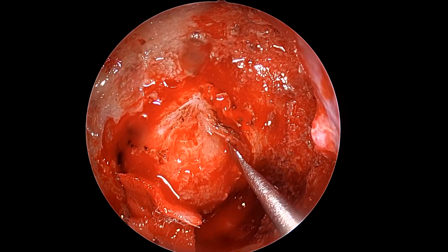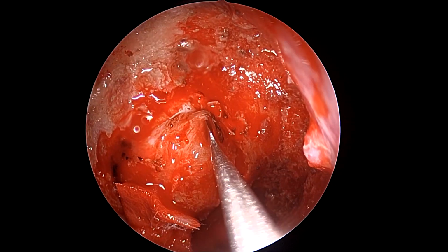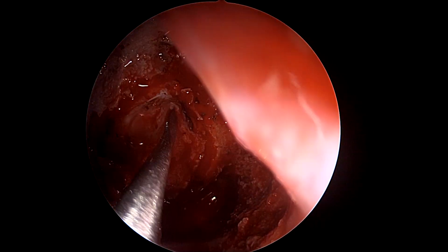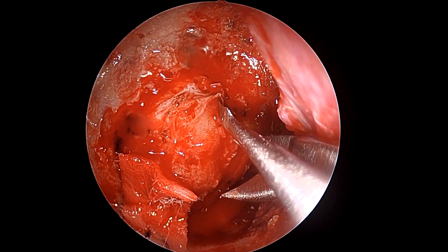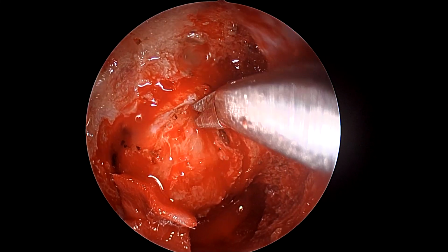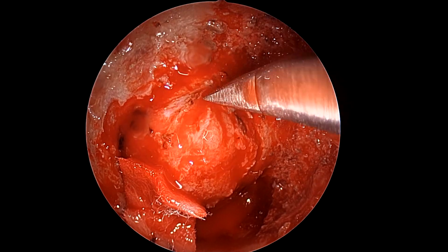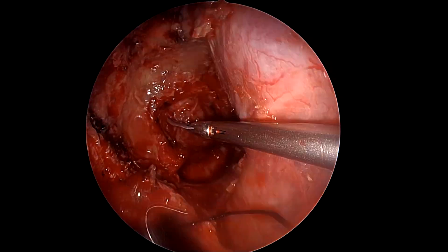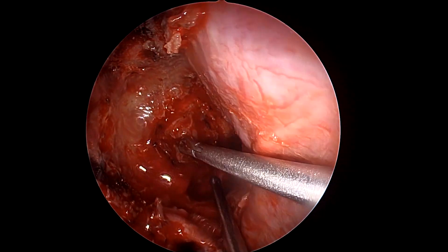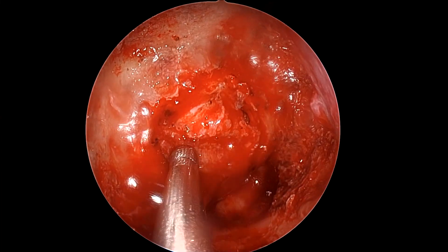And once we know that we are safe and we're not getting any pulsations, we could probably use our second knife to gradually, slowly open the sellar dura to get access to the tumor, which we now can see in front of us. So obviously using all four hands here is very important. One hand could just retract, one hand could simply cut, and that makes the job far easier than one hand itself. And you can see how we are coming from inside the septal flap, which obviously saves any trauma to the other side of the lateral wall of nose.